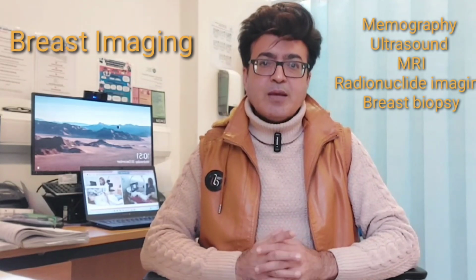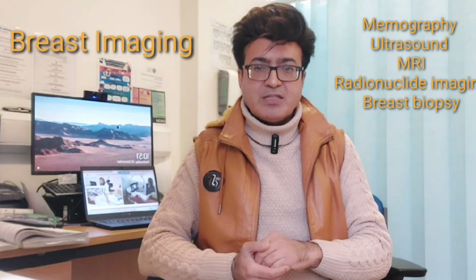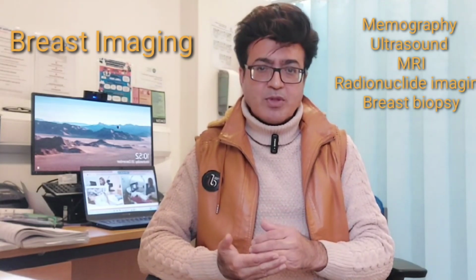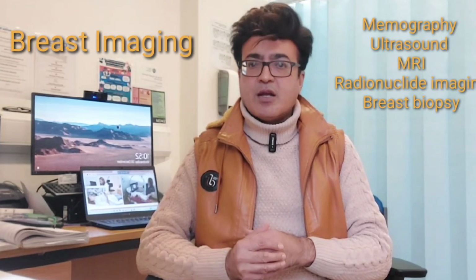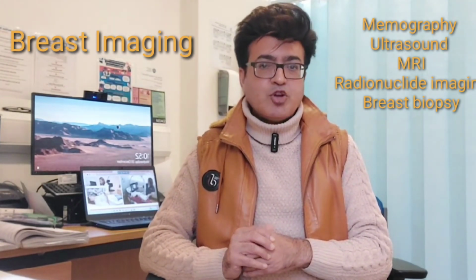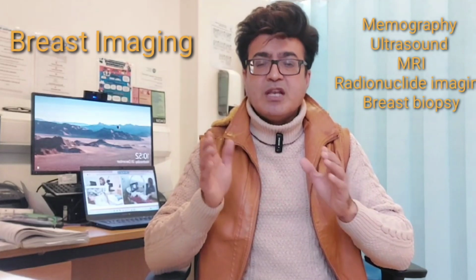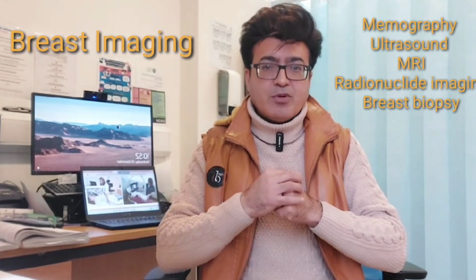In this video, I will first explain the anatomy of the breast, the different components of the breast, and second, I will discuss how many diagnostic tools are available for the diagnosis of breast lesions. Like the topmost is mammography. I will discuss mammography, its different views and its different positions.